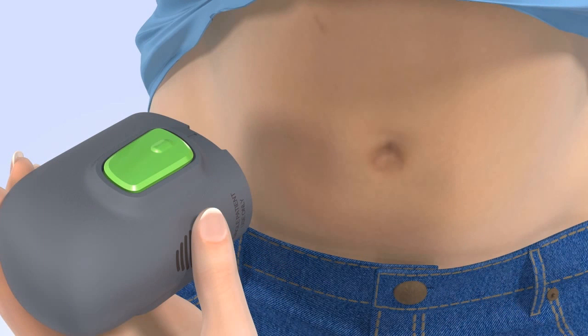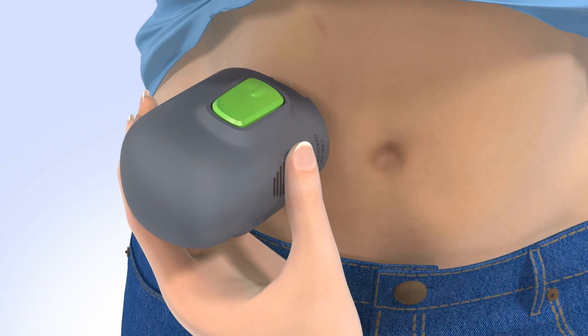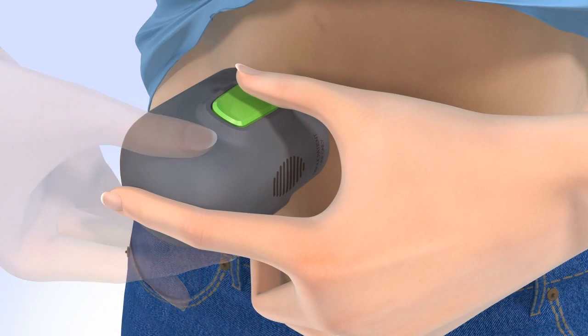Place the base of the surter flat against the site that you prepared. To insert the N-Lite sensor, be sure you are holding the surter securely against your skin without pushing it in too deeply. Press and release the small bump on both green buttons at the same time to automatically insert the sensor. It is important you hold the surter securely against your body while you do this step, as the surter may spring back after pressing the buttons, resulting in improper insertion of the sensor.